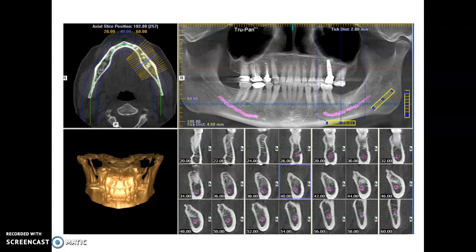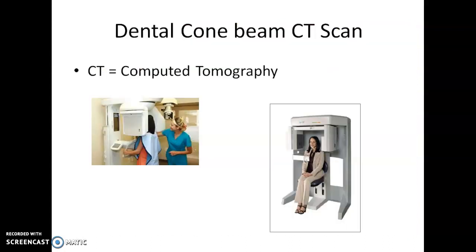It seems very foreign, but it really isn't, and I wanted you guys to have a chance to look at these so that if you get into an office that does use the CT scans, it's not as foreign. You don't look at them with a confused look. You know what you're looking at, and you know how to read them a little better.